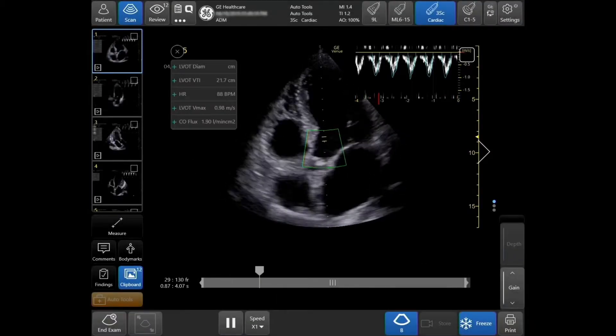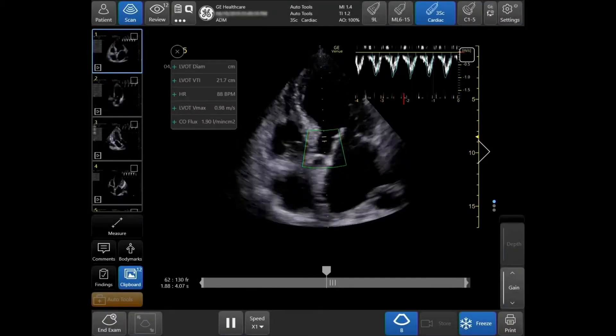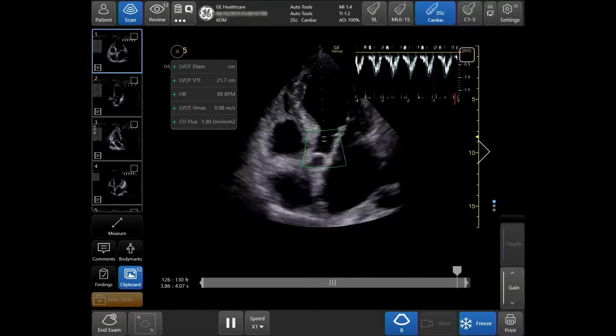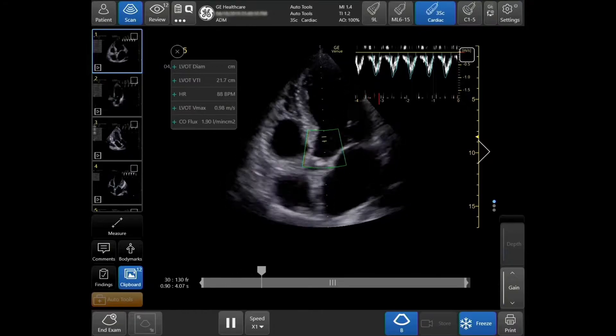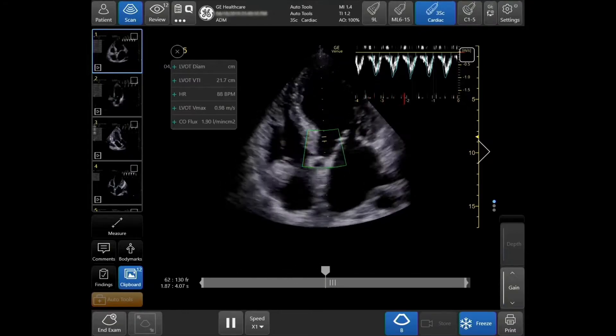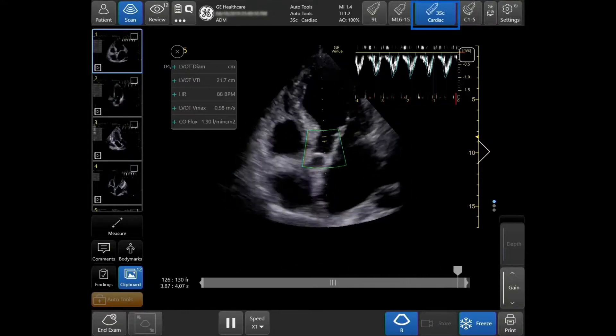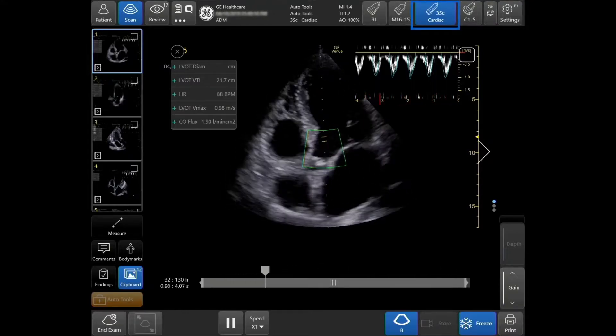Select the correct probe and preset in order to properly use the Auto VTI tool. In this case, the 3SC probe and the cardiac preset are used.